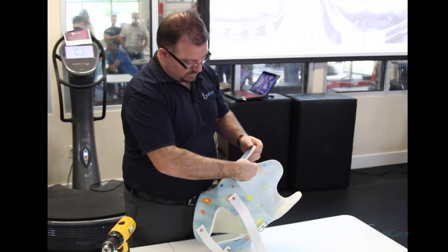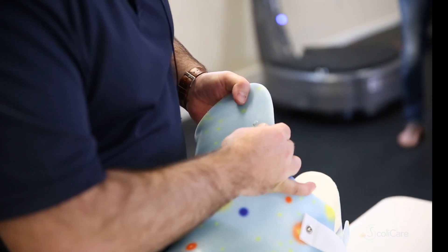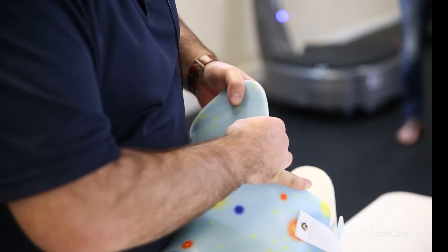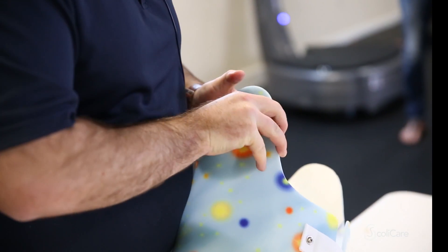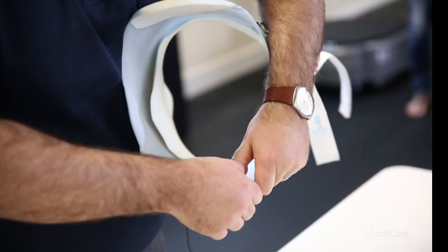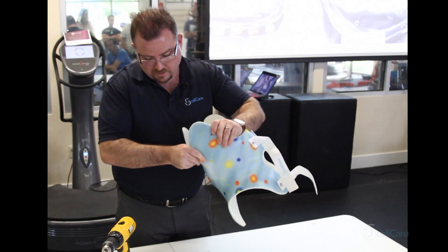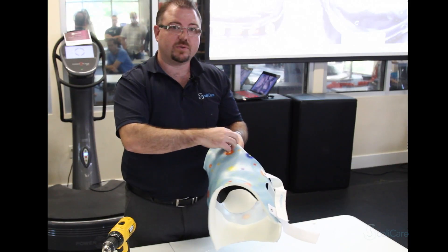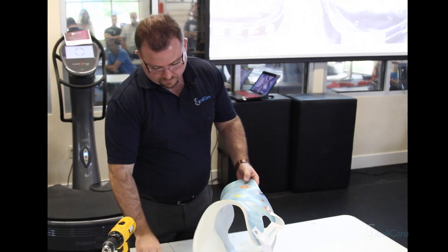Then take our little rivet, pop it into the brace and push it through. You want to make sure that it sits flush with the plastic so that it's not digging into the patient. That will come all the way through, and in fact when we screw it up it'll draw the end of the rivet back into the foam.